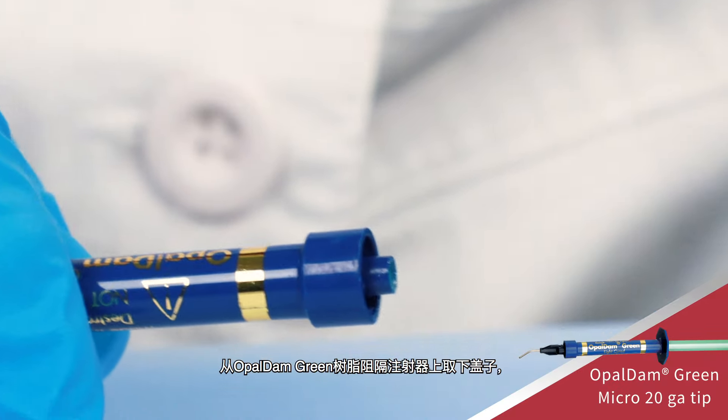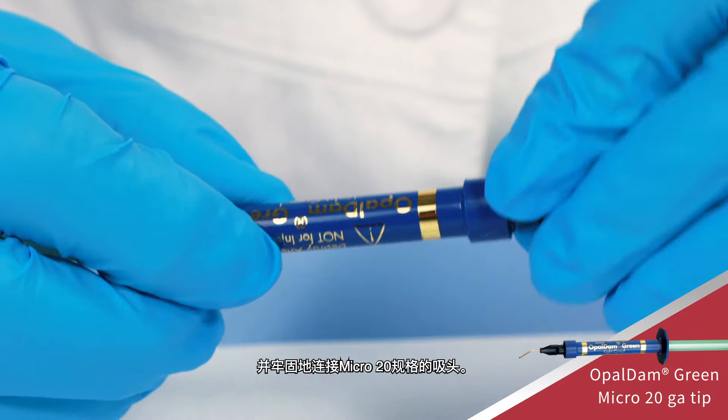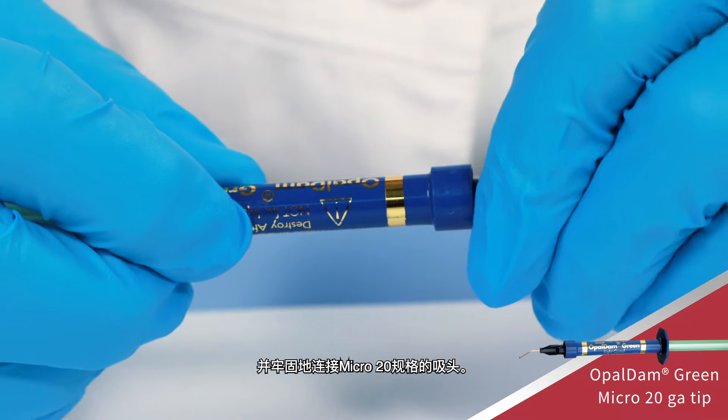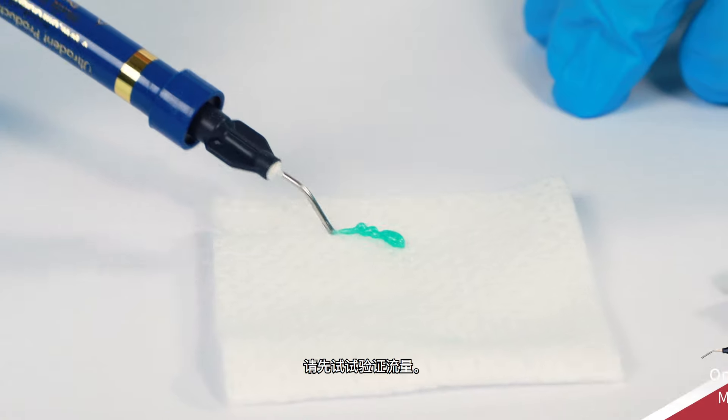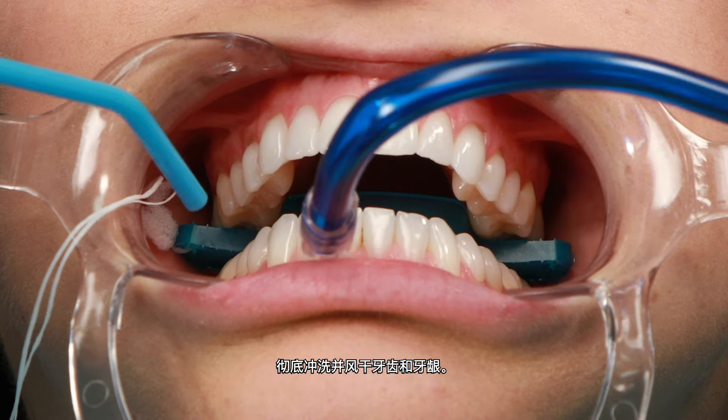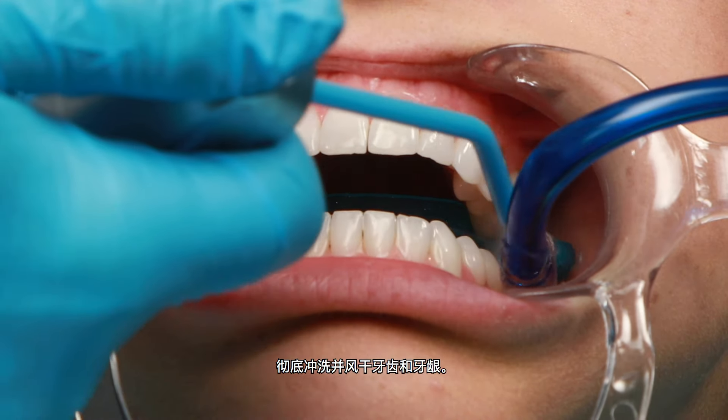Remove the LuerLock cap from the Opal Dam Green Resin Barrier Syringe and securely attach a micro 20-gauge tip. Verify flow prior to placing intraorally. Rinse and air-dry the teeth and gums thoroughly.